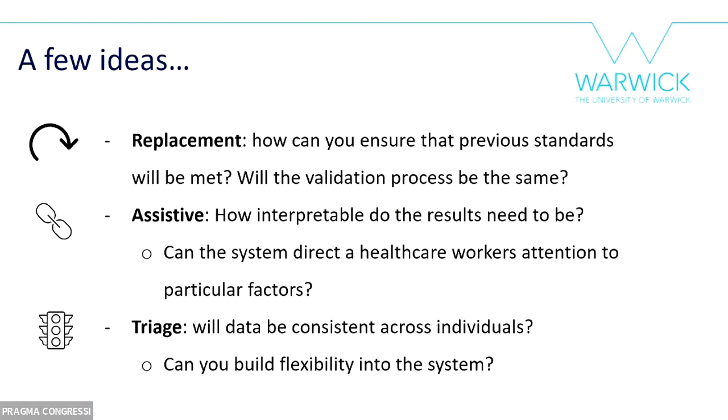So for replacement, like you said, it's kind of a controversial topic for sure. Probably one of the biggest issues is how can you ensure that the previous standard is being met? So is the validation process going to be the same? That's a very open question for sure.